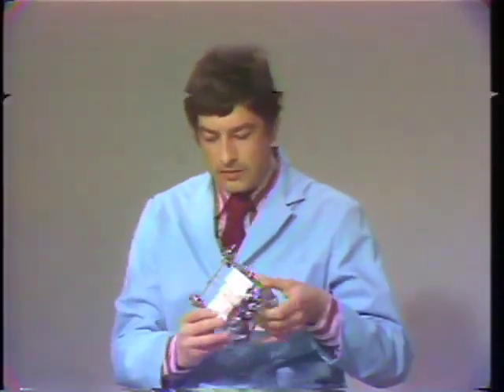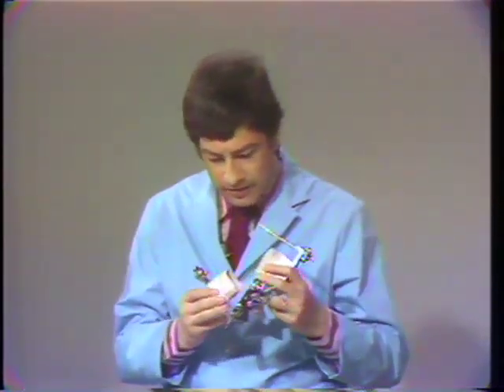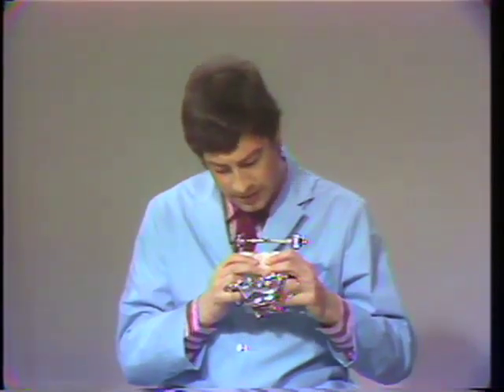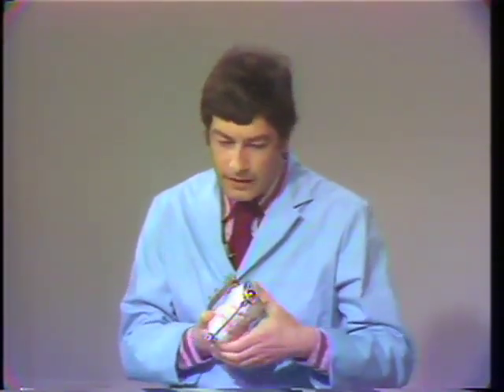It has been improved in everyday practice as a method that furnishes precise data, is easy to work with, and can therefore be accepted as a highly rationalized way to comprehensive dentistry. The transfer of data from the patient on an articulator provides the opportunity to study on mounted casts the functional relation of antagonistic teeth, even from an intraoral side, in a more precise and detailed view. Prosthodontic reconstruction built in an articulator adjusted to the patient's data affords a harmonious function with a minimum necessity of adjustment after insertion.